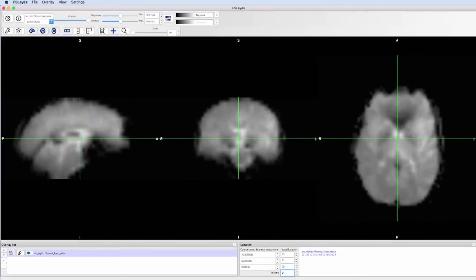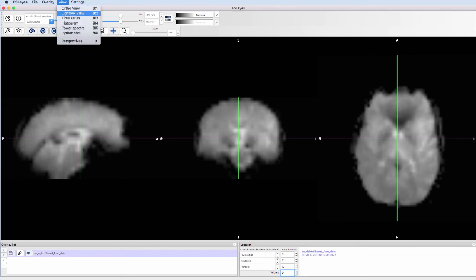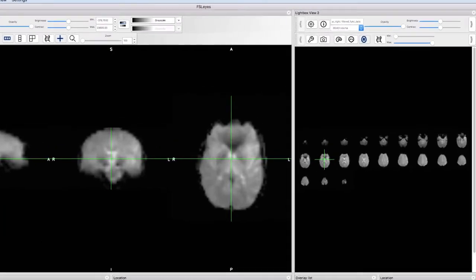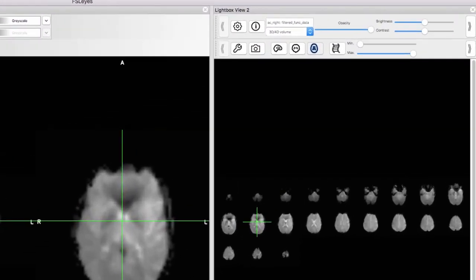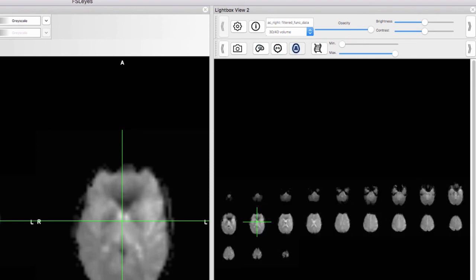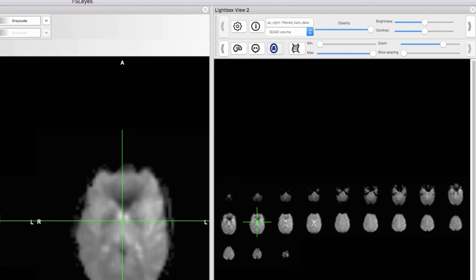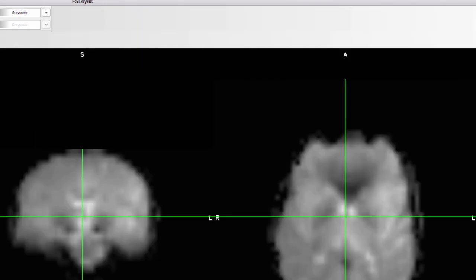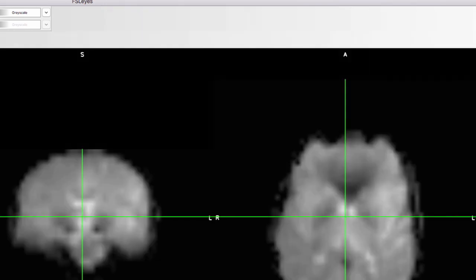We'll look at one more viewing option, called the Lightbox view. Click on View and then Lightbox. This view shows slices in the sagittal, coronal, or axial dimensions. By default, all the slices are displayed. You can change the slice spacing if you wish. Click on the X in the upper right corner to remove the Lightbox window.